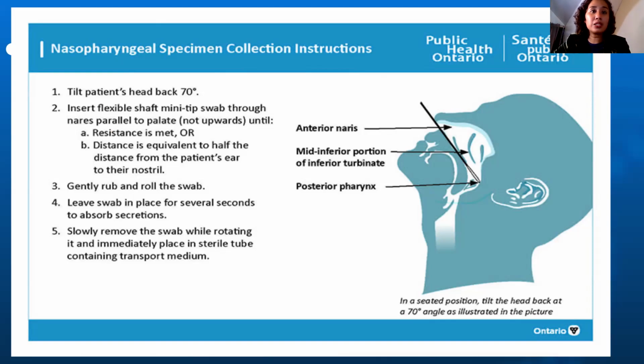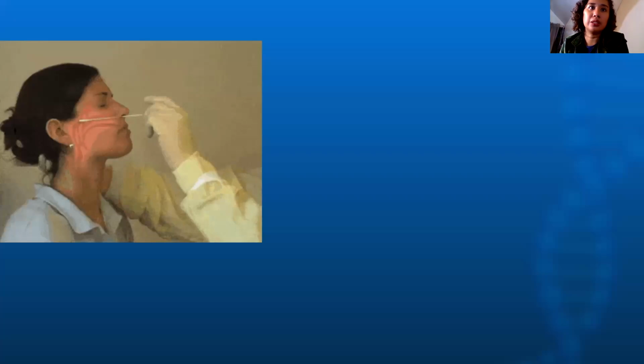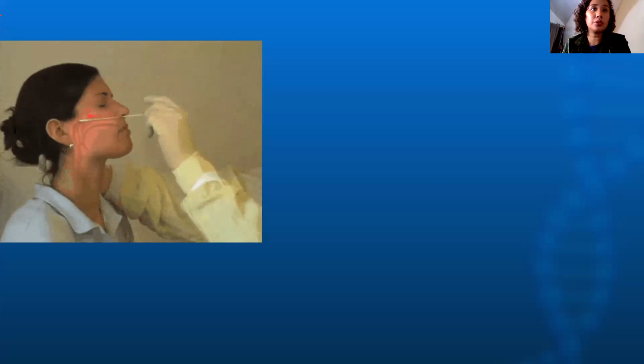Leave swab in place for several seconds to absorb secretions. Pero usually parang may experience ang bilis nila ginagawa. Slowly remove the swab while rotating it and immediately place in sterile tube. So usually yung viral transport medium, VTM, containing transport medium. So in a seated position, tilt the head back at 70 degrees angle. I think kulang pa yung tilt, pero pwede na rin. So straight yung swab.